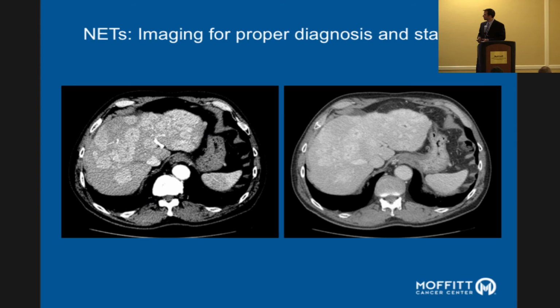This is another example of a patient with pancreatic neuroendocrine tumor, metastatic to the liver, and just the importance of this multi-phase imaging. So, very, very extensive metastatic disease burden in the liver. And you can see, if you only acquired one early time point, you can see the mets. But a lot of times for measuring response to therapy, and particularly for clinical trials, the actual measurements of the tumor are very, very important and can determine outcomes. Sometimes that's not an entirely 100% legitimate way of knowing what's going on, but it's still the most objective way.